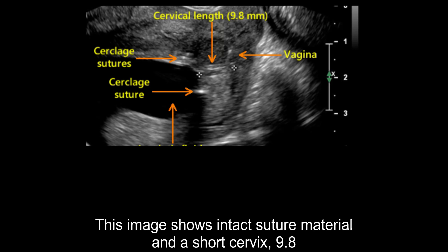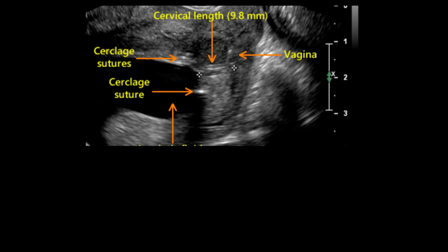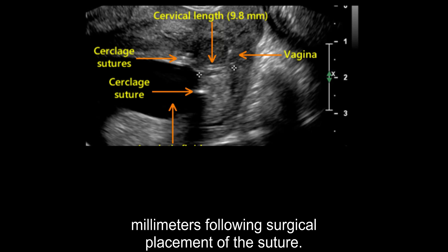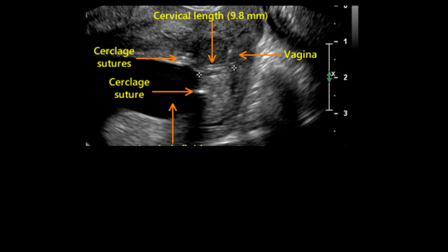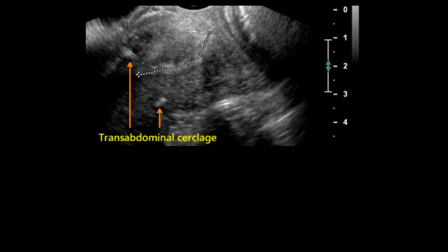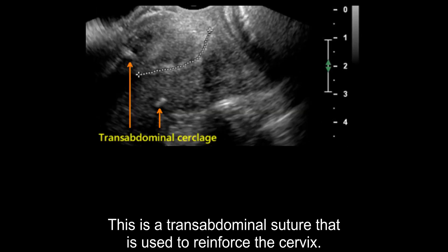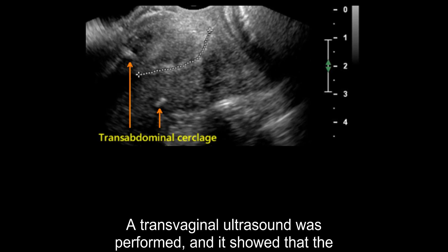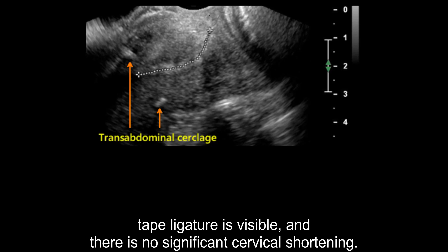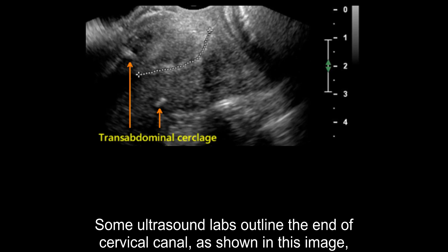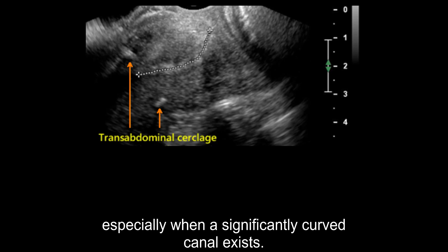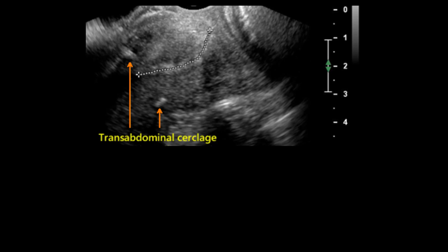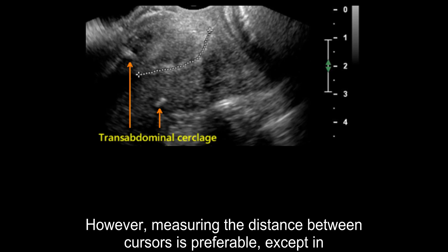This image shows intact suture material and a short cervix of 9.8 mm following surgical placement of the suture. This is a transabdominal suture used to reinforce the cervix. A transvaginal ultrasound was performed, and it showed that the Mersilene tape ligature is visible with no significant cervical shortening. Some ultrasound labs outline the endocervical canal, especially when a significantly curved canal exists. However, measuring the distance between cursors is preferable, except in extreme cases.